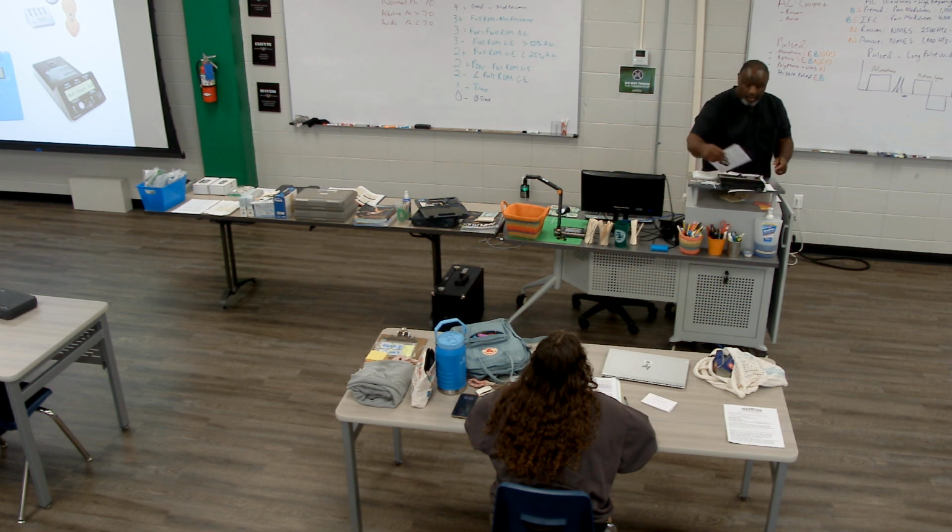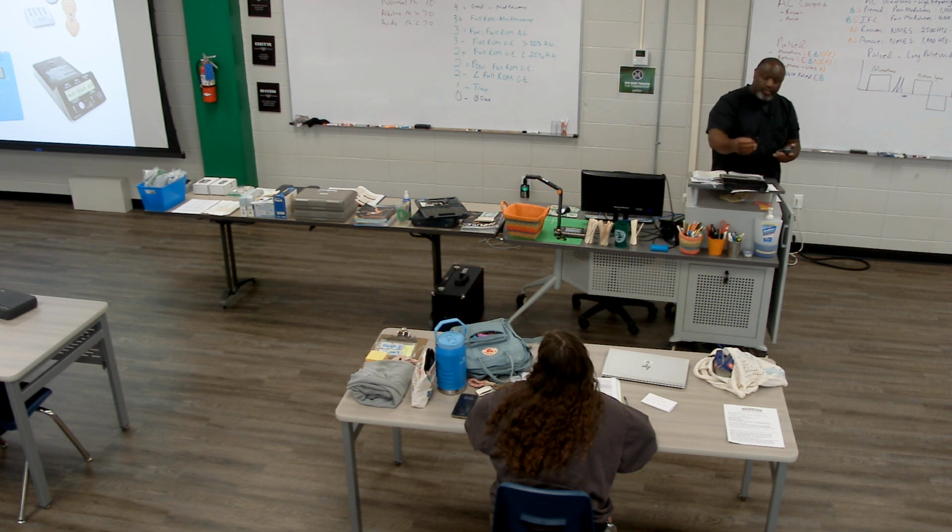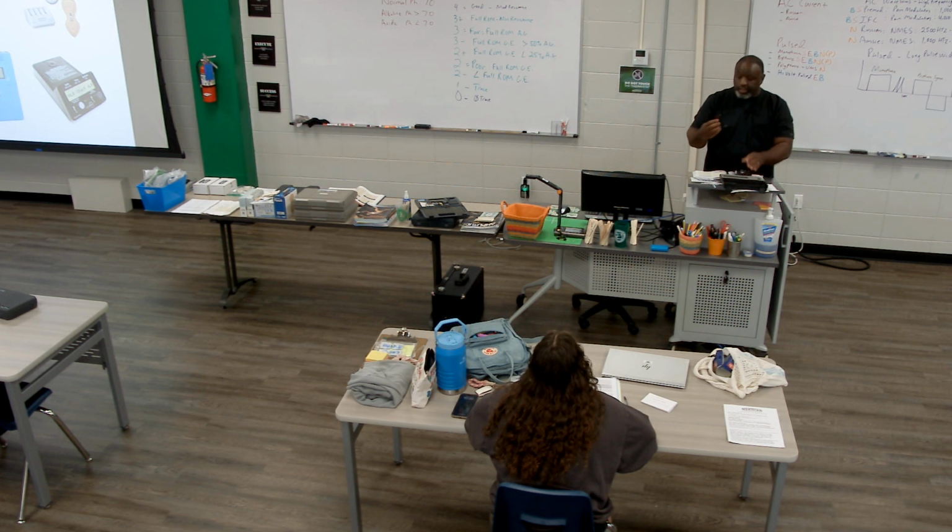Same manner, this is an iontophoresis device. Same concept. This is iontophoresis here. It runs on a 9-volt battery. This is the electrode. You'll see that the electrode is different than any electrode that we've dealt with before, or the lead wire, excuse me. The lead wire is different.